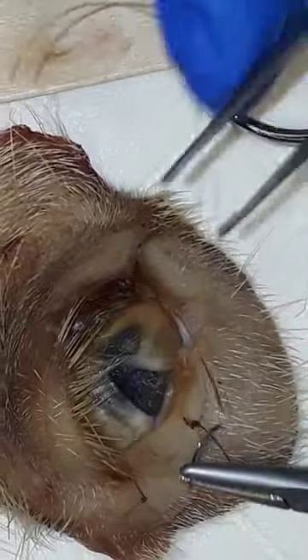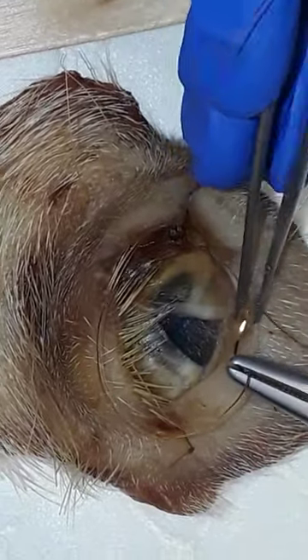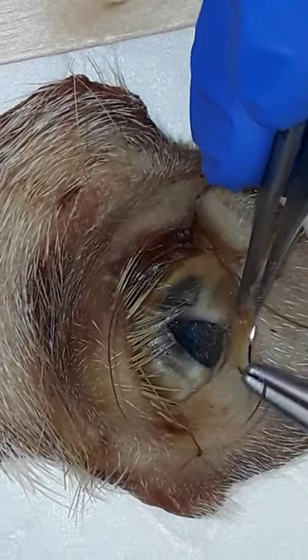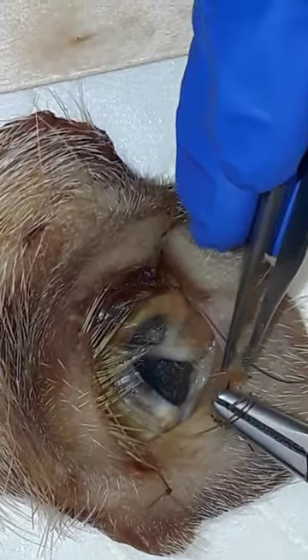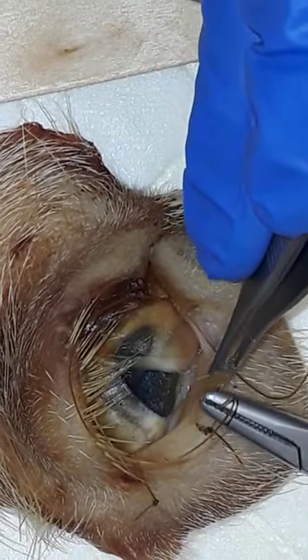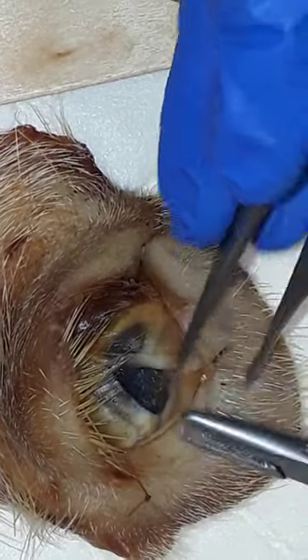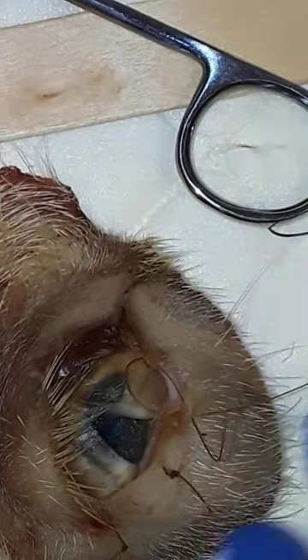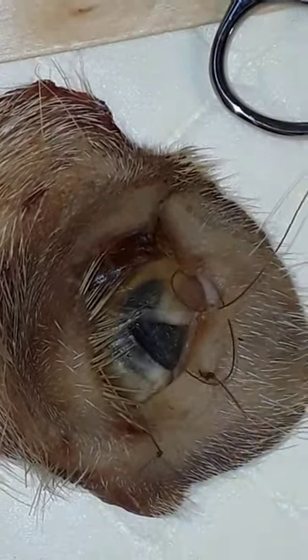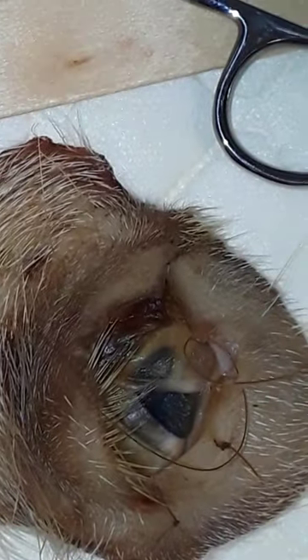This actually feels like a piece of jerky, so I apologize for that — it might need some saline to rehydrate the tissue. Now I'm going to go into that edge of the defect on the opposite side and come out of the skin.